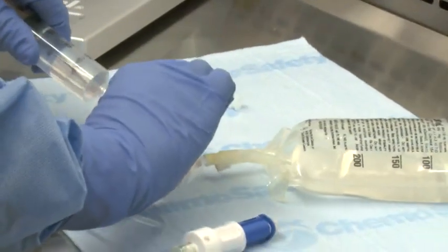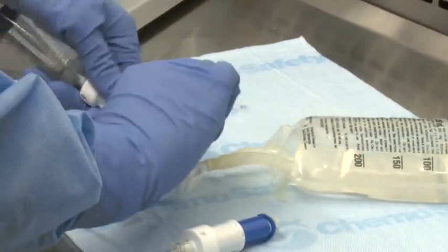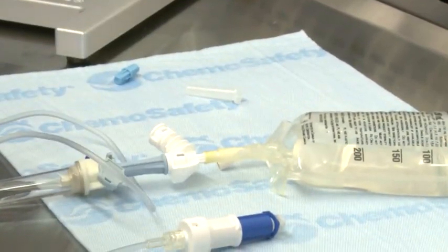Finally, disengage the syringe unit from the infusion adapter using the pull-turn-pull technique. Repeat the steps if additional syringe units are required for dose preparation. The IV bag is now ready for administration.